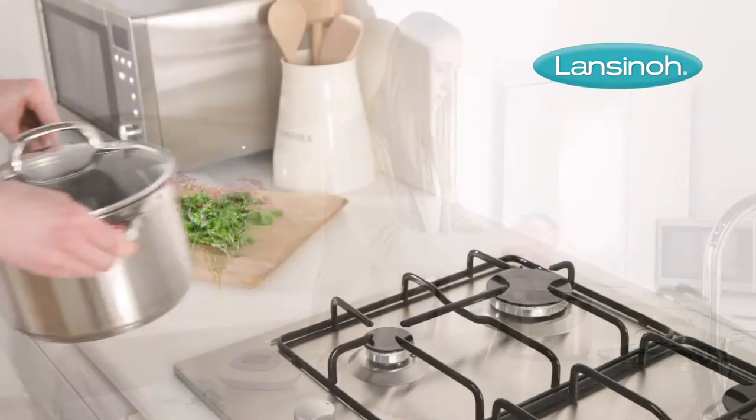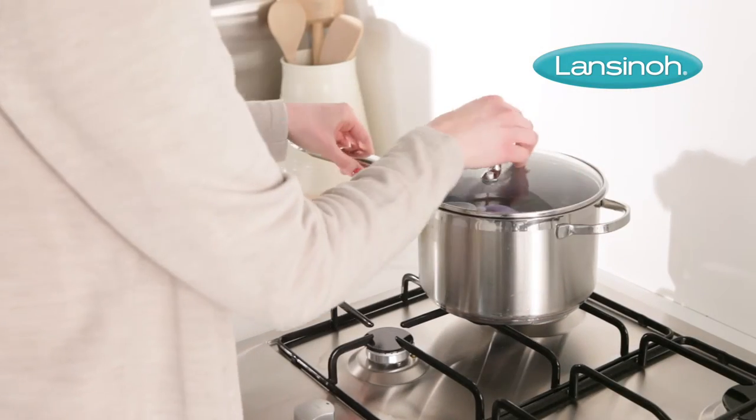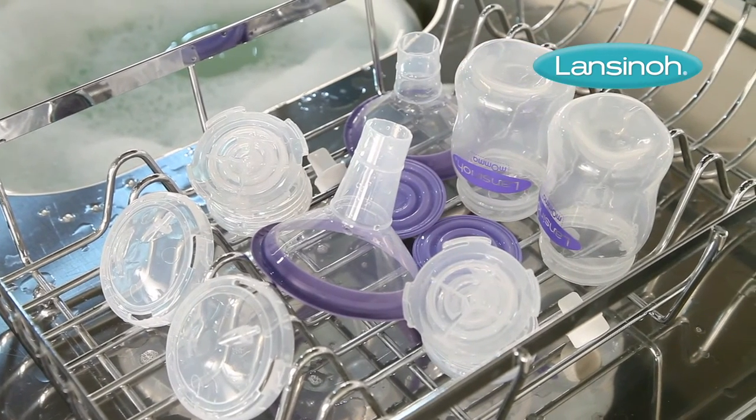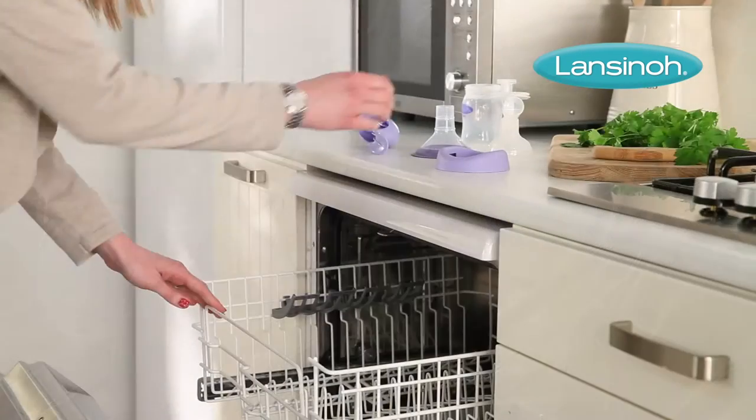Make sure you use enough water to keep all the parts afloat while boiling. Once cooled, carefully remove the parts and allow them to air dry before assembling.